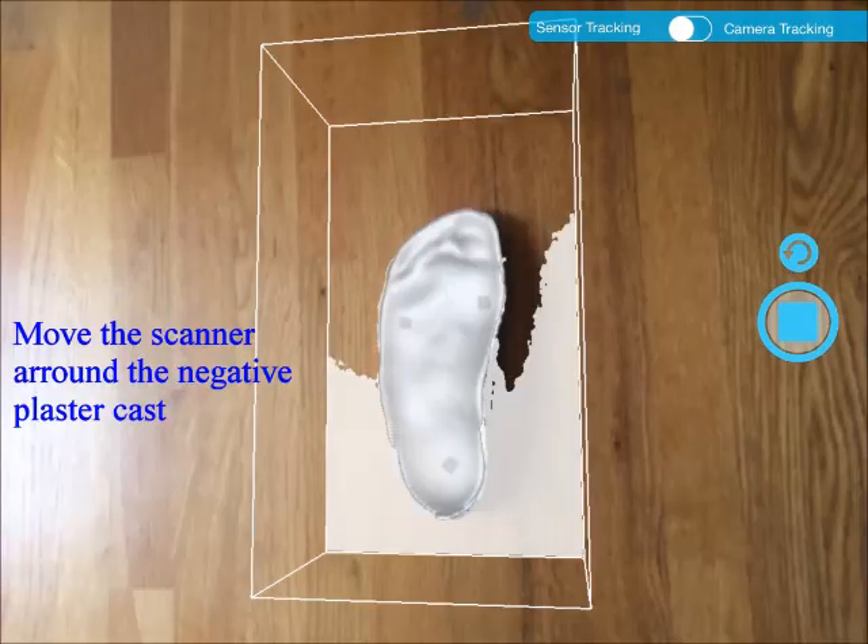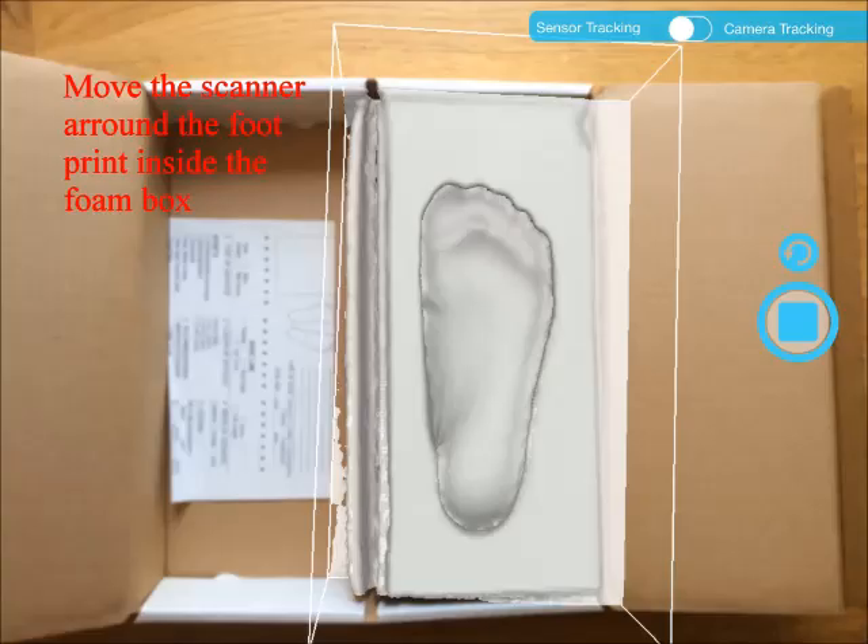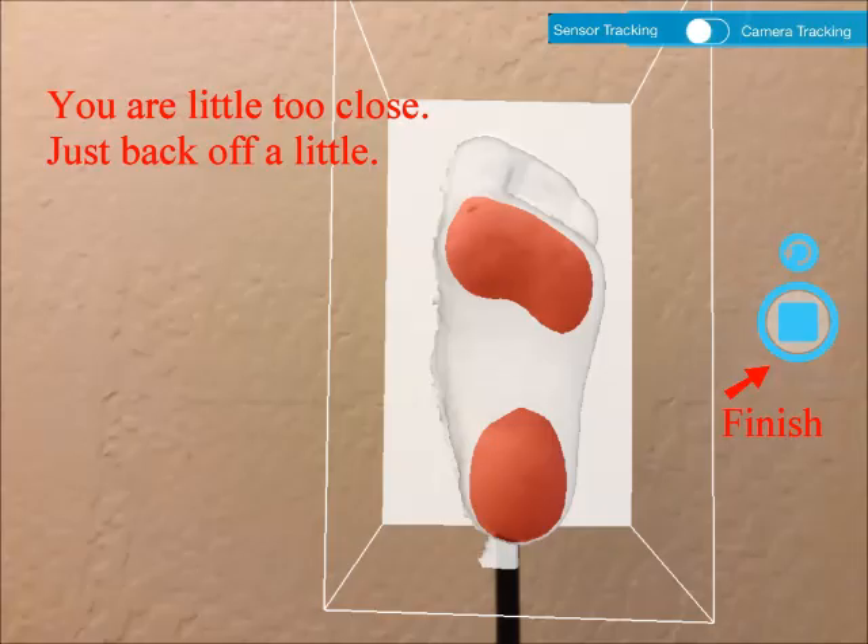If you are scanning a negative cast, the plaster slurry will congeal inside the cast and some will spill on the floor — that is okay, just keep moving. If you are scanning a foam box, the plaster slurry will solidify inside the footprint and also on top of the box. Try to make your moves to catch the inside. You need to scan one foot at a time, not a pair. During scan, you may be too close to the foot — the indication is that patches of red area appear on the foot. Just back off a little. We recommend you move close to the foot, and when you see the red area, then back off. That way, you know you are in the closest range possible.